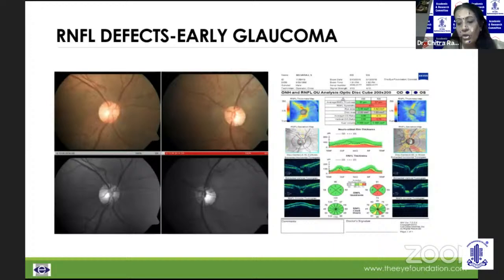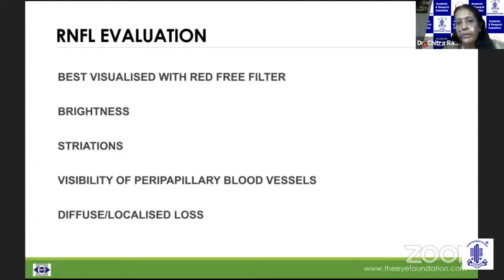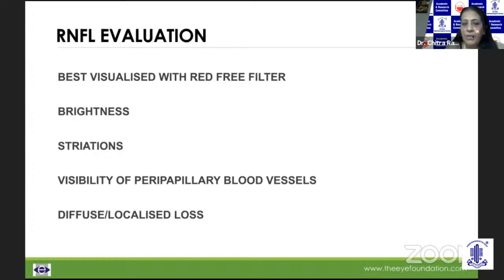The RNFL is best evaluated with a red-free filter. These are axons running from the upper to the lower pole towards the peripapillary region, and they have their own luster, giving the impression of striations. When there is degeneration of RNFL fibers, peripapillary vessels become more prominent. In fact, the area of RNFL defect could be double the size of the venule. These could be slit defects, wedge-shaped defects, or diffuse loss.